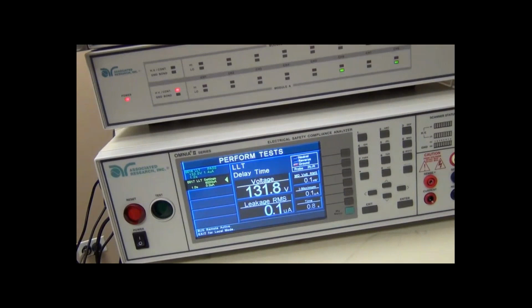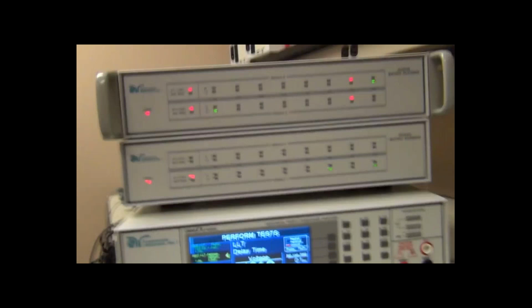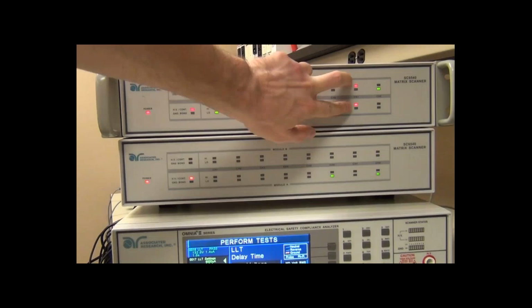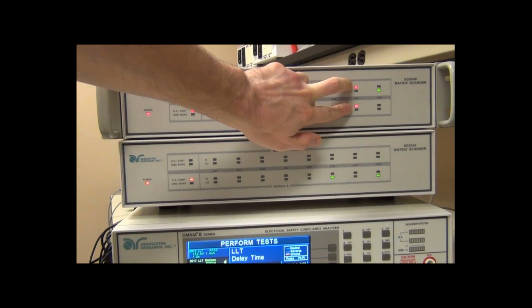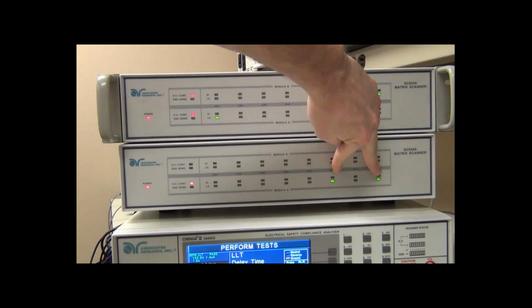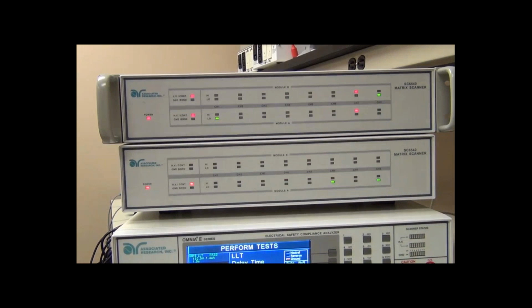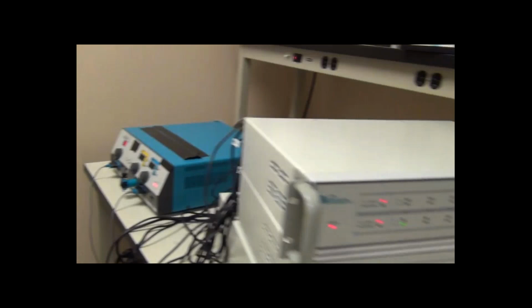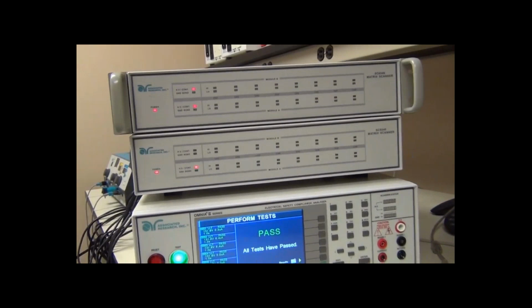And then finally, on our last mains on applied part test, I flipped the polarity of this circuit. Now we have neutral connected to probe high, probe low connected to patient lead 1, while line voltage and PE are shorted together on the medical device. You can actually see it powered up here doing its thing. And the test sequence has completed.